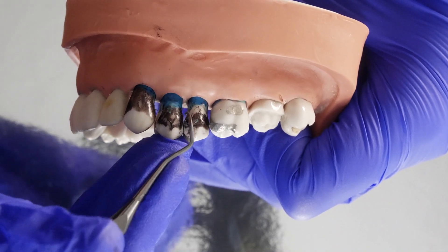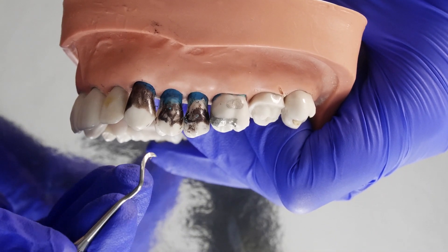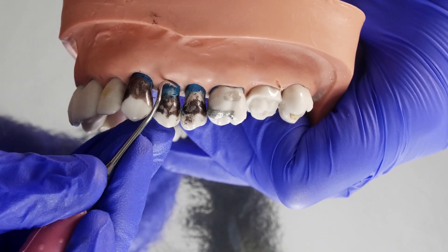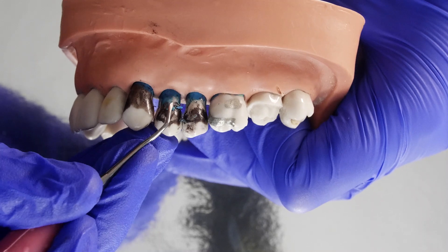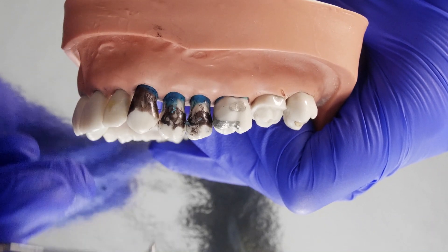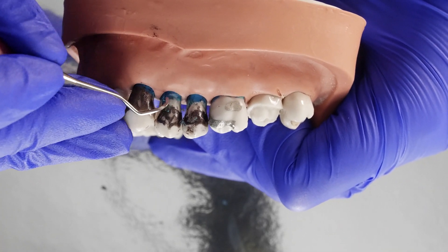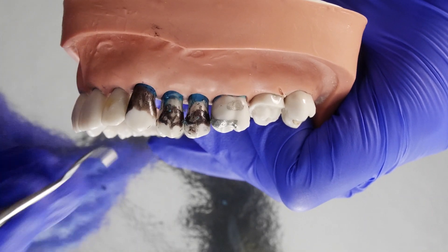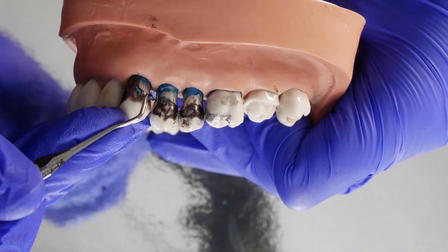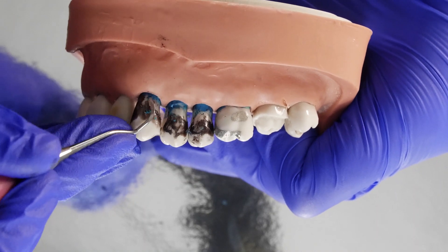You might be able to hear little scraping sounds and that's fine. In terms of pressure, I'm applying moderate lateral pressure. You shouldn't have to apply too much pressure if your instrument is sharp. So let's do another tooth — start in the middle and again short sharp strokes up. Here I'm going vertically, but you can also use oblique or horizontal strokes. I can demonstrate that for you now. This is a horizontal stroke — be very careful of that tip though.